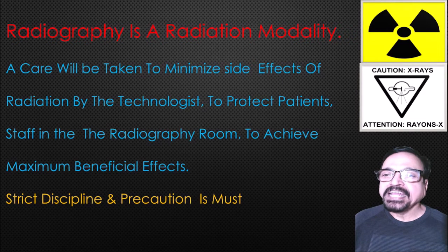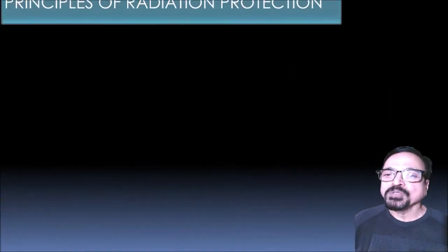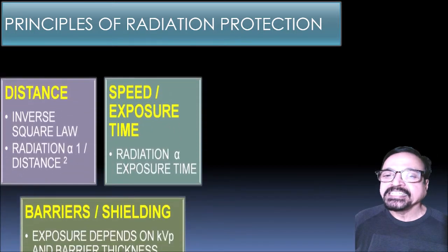Now, radiography is a radiation modality. Care will be taken by the technologist to minimize side effects of radiation, to protect the patient and staff in the radiography room, and to achieve maximum beneficial effects to the patient while minimizing the side effects. Strict discipline and precaution is a must. We repeatedly speak about it in almost all the lectures on radiation, since it is very important.